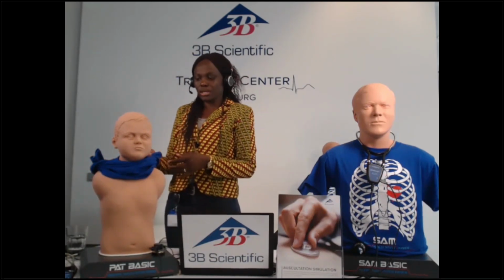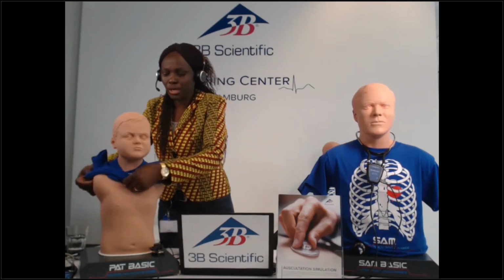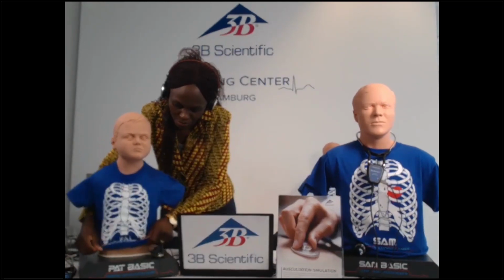And later on, as you'll see, you can either decide to do the auscultation with the t-shirt on, or you can decide to remove the t-shirt from the pediatric version of it, or for the SAM version. So the first thing that you get is the portable torso. Then the second thing that you get in your delivery is this one here. I hope you can all see it.